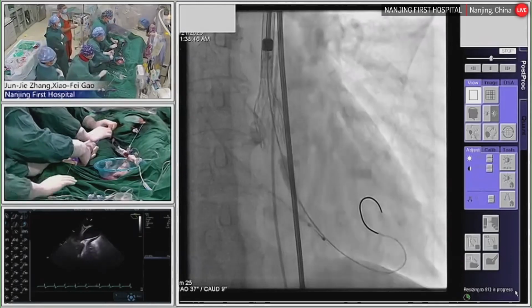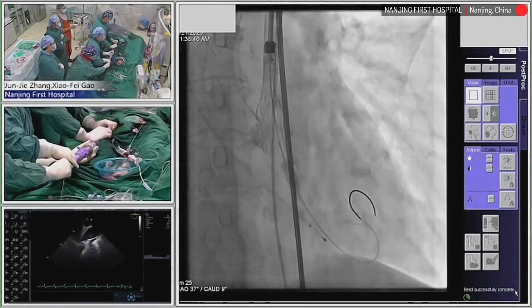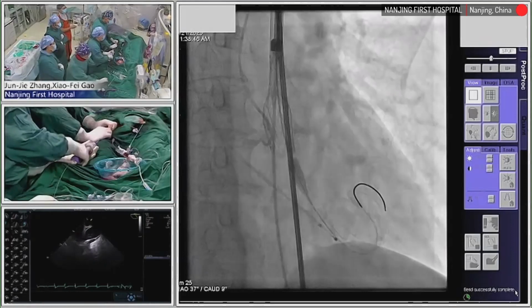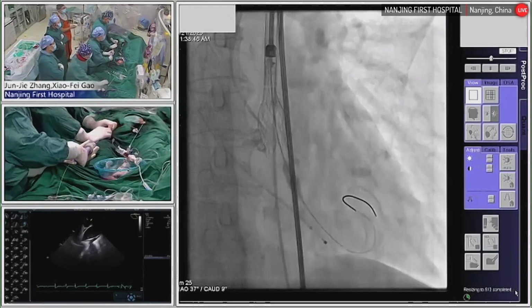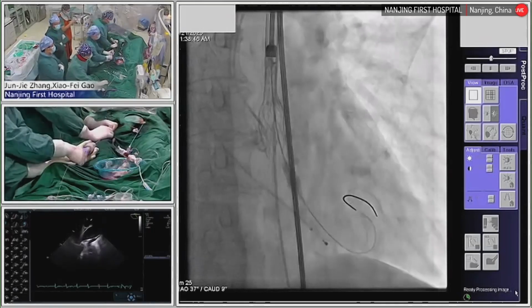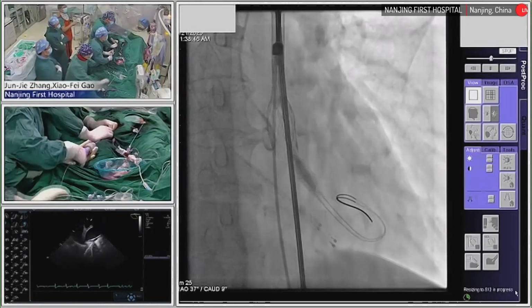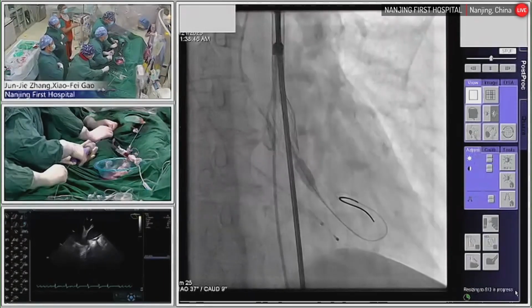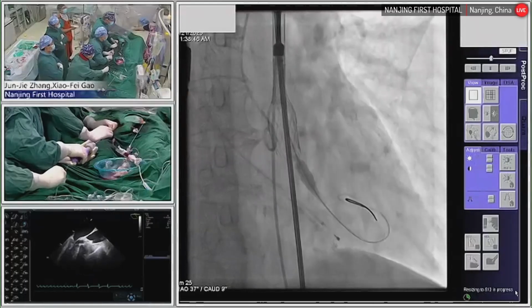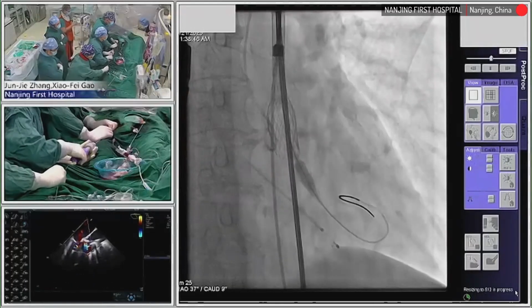carina. Okay. 导丝后侧不用再顶了。Okay, now I ask my assistant, my colleague to pull back the wire, release the tension, and pacing 114. 释放。张娟 Okay, echo monitor looks good, bro. 120.